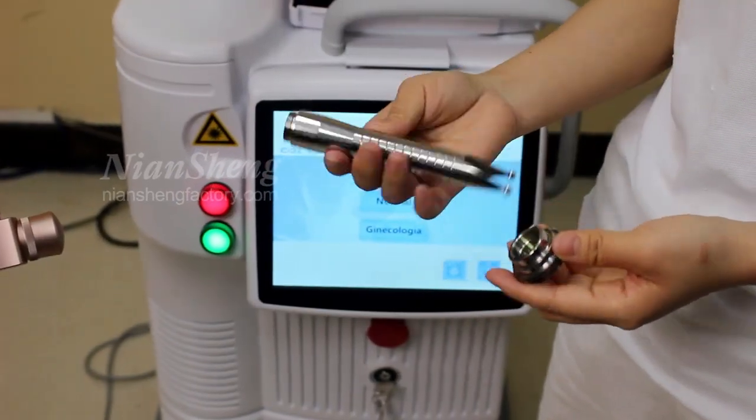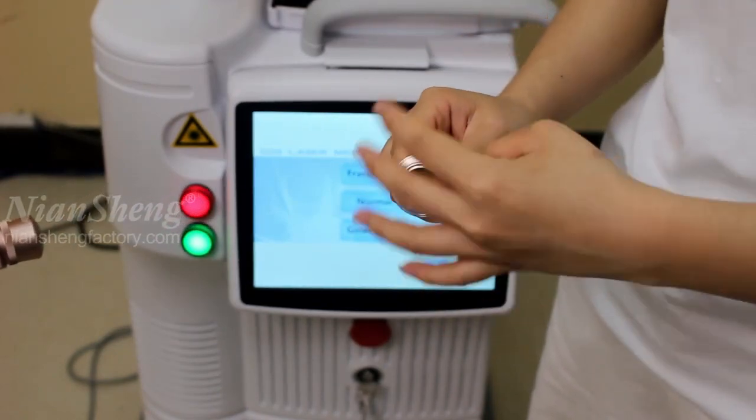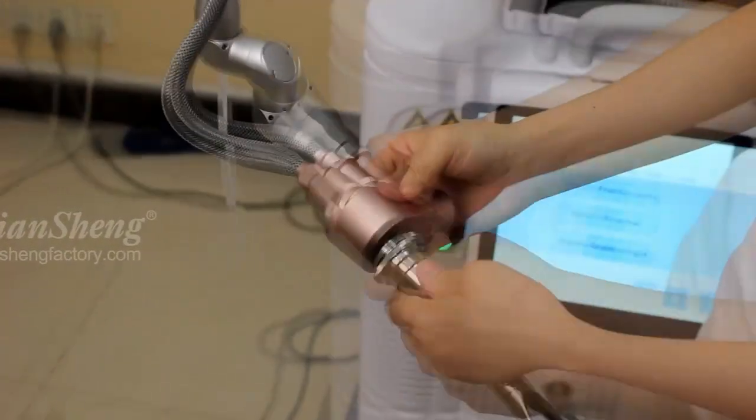Now next, I will show you how to install this other handle. It's also the same steps: connect this mask, press it, and then connect here. That's okay.